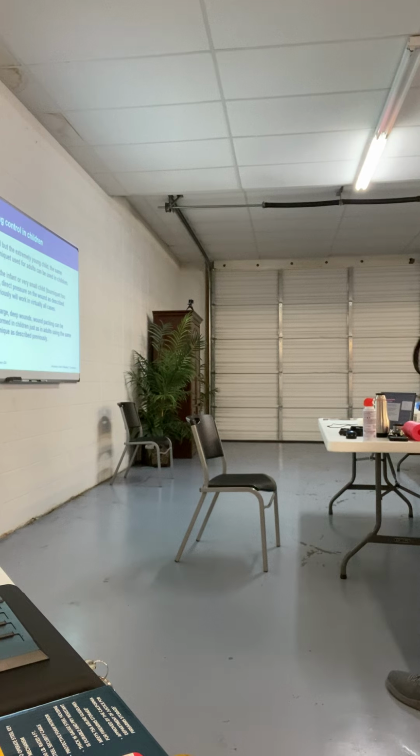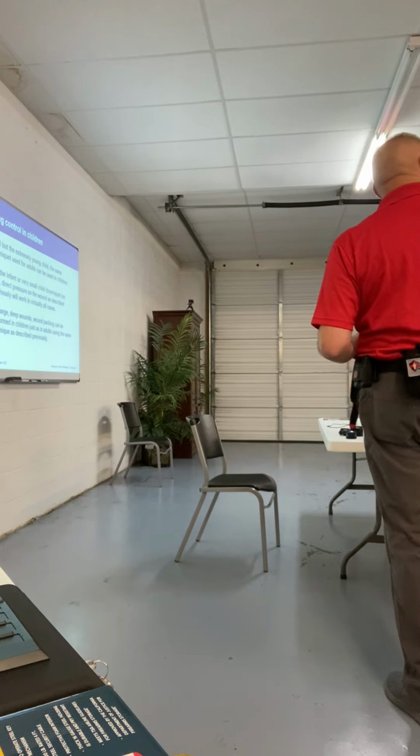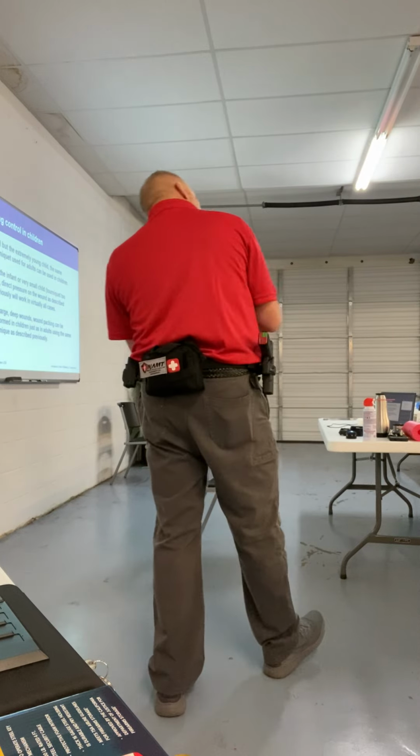What's that? You can use the dog's leash. Like, you can use the dog's leash. It's not stretched. I mean, this is super kind of plastic, but yeah, you can use it. I was just thinking you could use that, and then use a stick or something as a windlass. Okay. Yeah. But you don't want to use leather belts, just because they don't twist and cause compression.